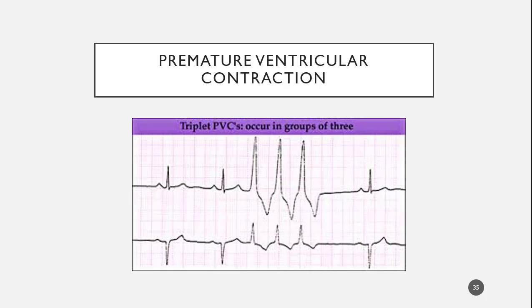We know about this QRS — look how narrow it is. And then we look over here at this one, and it's going in the opposite direction. This one, you might be able to make an argument that this may or may not be ventricular.